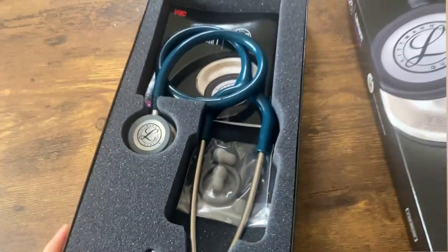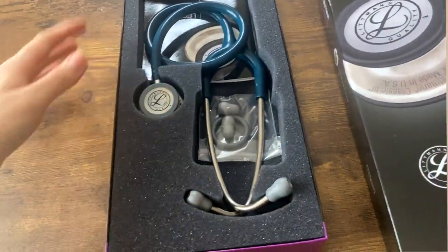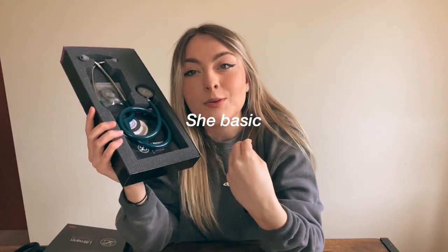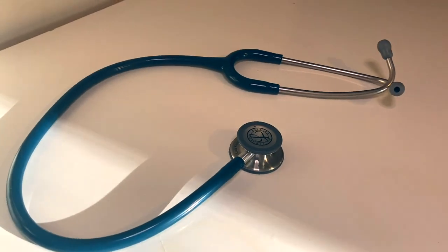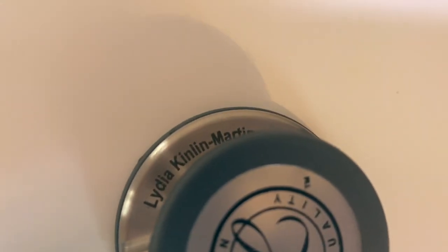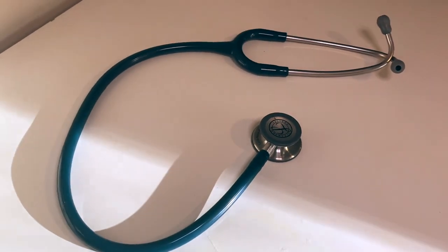So here it is in its box. I basically wasn't sure what colour to get — it took me a really long time to decide. I know some people don't really care what colour it is, but that's something quite important to me. I wanted to pick a colour I knew I was going to love. I'm really happy with the colour I went with — Caribbean blue.